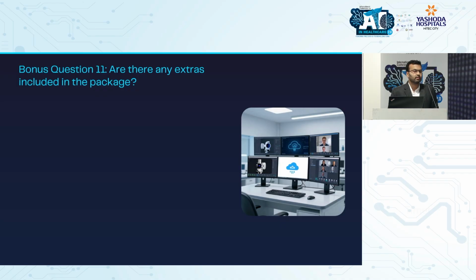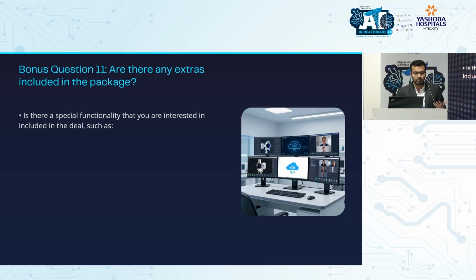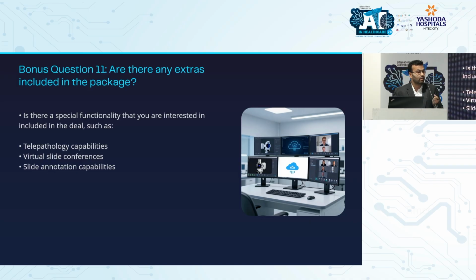All right, and then is there anything extra included in the package? Like how Madam was just telling us, they wanted to scan slides, view slides, but telepathology software was not provided, right? So that is an issue which we faced previously also. The scanner costs like say X amount, and the software costs somewhere close to the X amount only when you're using some brands. But these days it comes as a package. Like as we say, once it entered the mass market where a lot of people started buying scanners, then all these things came up. Telepathology capabilities, virtual slide conferences, slide annotation capabilities, the ability to download your slide.